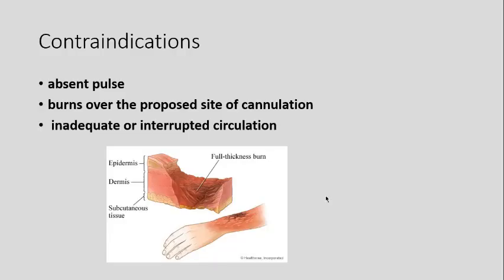Contraindications for this procedure are absent pulse, burns over the proposed site of cannulation, more specifically full thickness burns, as can be seen in the picture, burns which go through the epidermis, dermis, and up to the subcutaneous tissue, and inadequate or interrupted circulation.